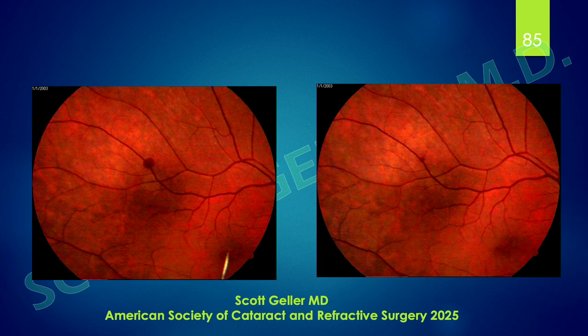The other thing that you can have is a retinal or choroidal hemorrhage. This is not caused by a complete strike on the retina. This is caused by residual infrared radiation that is absorbed by the choroid, and the choroid will bleed.